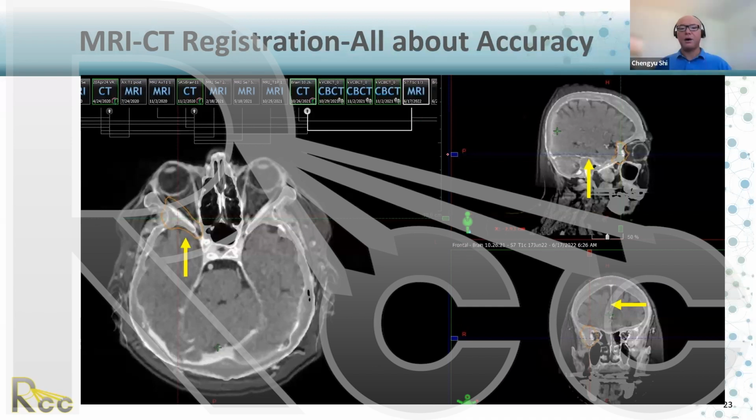So that one, during the registration, you will involve the rotation. A certain patient may rotate a lot. And in your brain, you have to have 3D visualization of the brain. And it is difficult, I know. When I use the I-plan treatment planning, it's so difficult to adjust the rotation and make sure that it aligns with CT not only in one plane, but also in 3 planes.